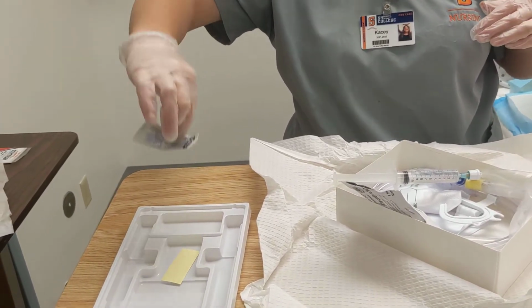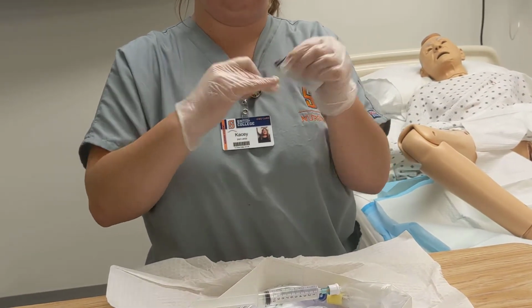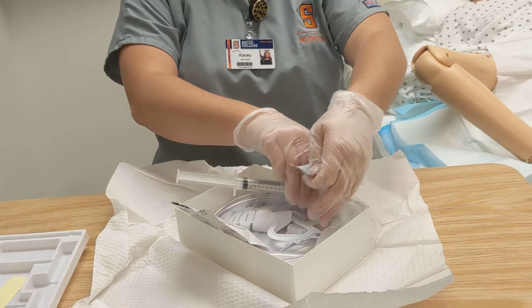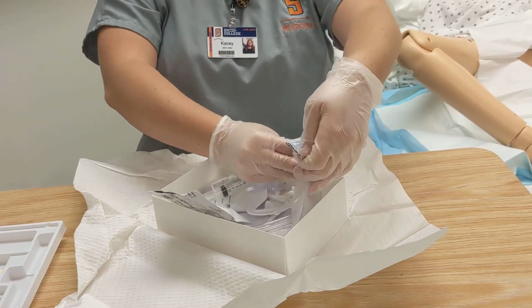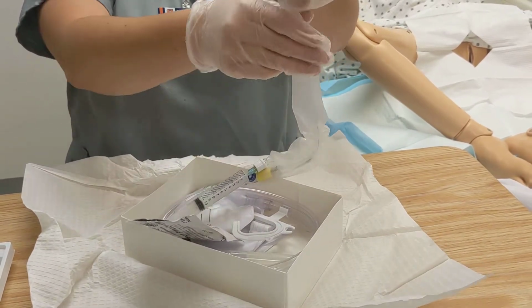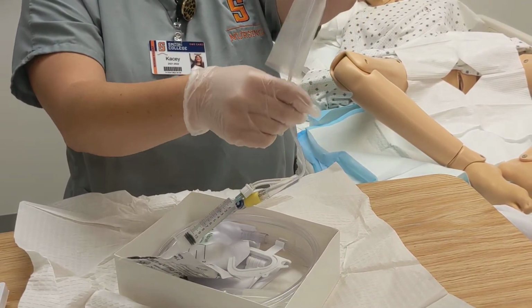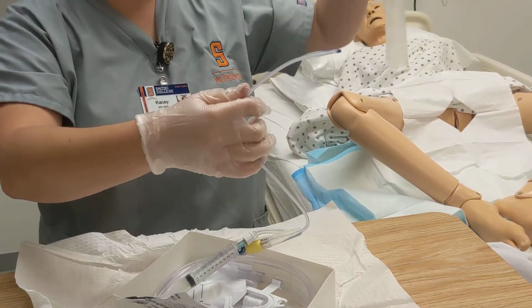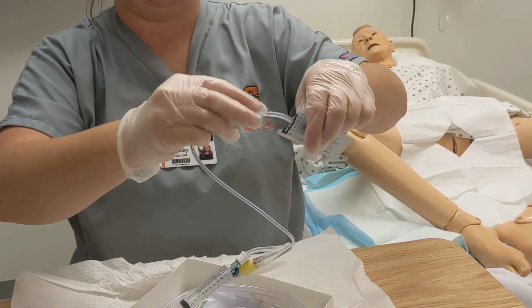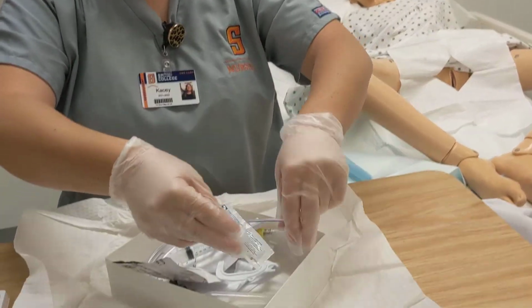And the inside of this is still sterile, so we just are making sure we only touch the inside. I'm gonna open up my lubricant. Keep that aside. Then I'm going to take my catheter and I'm going to take it out of this and put some lube on it. I'm just gonna stick it in here. Just lay it down in here.